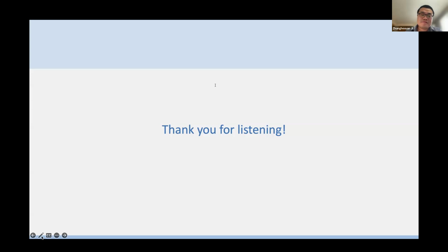Thank you. A question from Fausto. Maybe I didn't catch this detail so far, but how did you obtain your frozen encoder? Was it trained through self-supervised learning or something like that, or trained specifically for some task? In this work, we're not using self-supervised learning. As I said, we start with a comprehensive dataset, TotalSegmentator. It's a labeled dataset with over 100 organs and 1,200 patients.